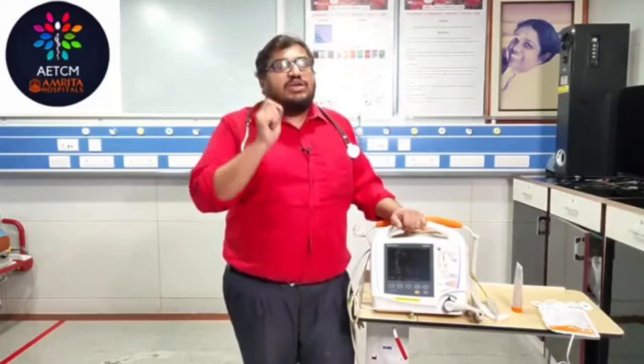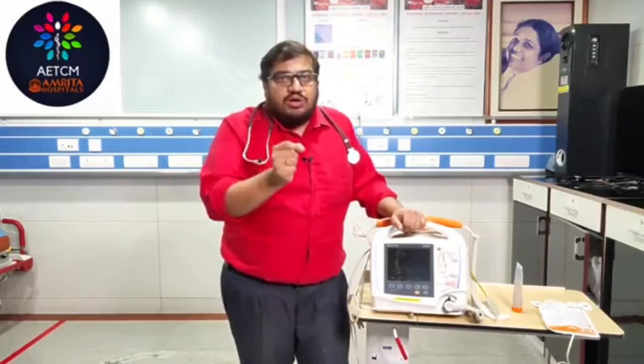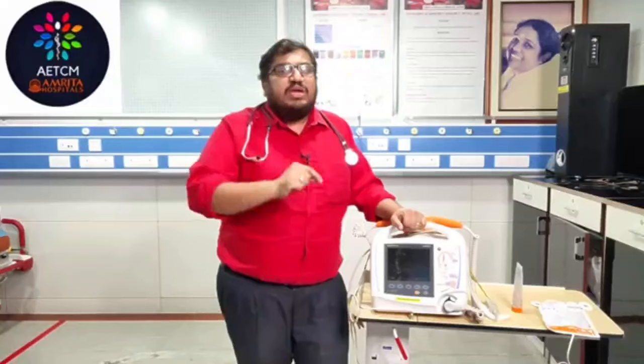And in cardioversion, there is another thing that you need to select, something called synchronization. Otherwise we can call it, cardioversion is always synchronized. Synchronized cardioversion. What do you mean by synchronization? Synchronization is that the shock will be delivered by the machine at the peak of the R wave, or the peaking of the QRS complex. Only at the peak of the R wave will the shock be delivered. So that is regarding your synchronized cardioversion.